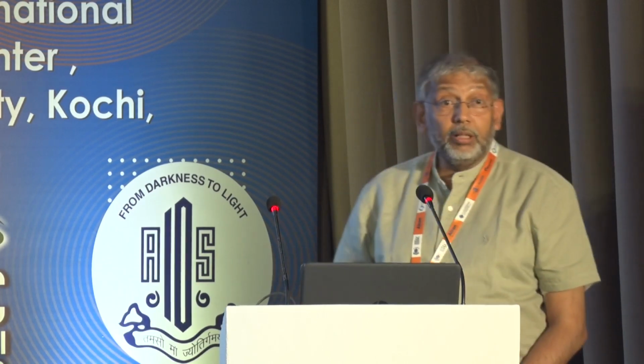As we age, the lens hardens and its spherical aberration changes from the negative to the positive side, so the total eye aberration becomes positive. This shows that once there is an increase in positive spherical aberration, the quality of vision goes down. So, what is an aspheric lens? We have to replace this positively aspheric aged crystalline lens with a youthful crystalline lens which had a negative spherical aberration. That's how the negative aspheric lenses work.